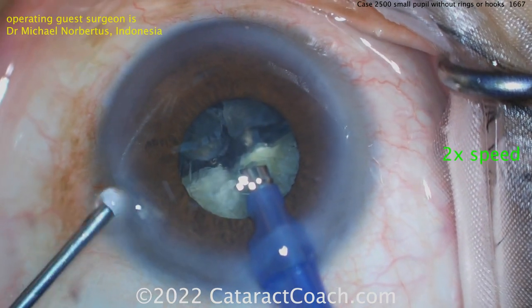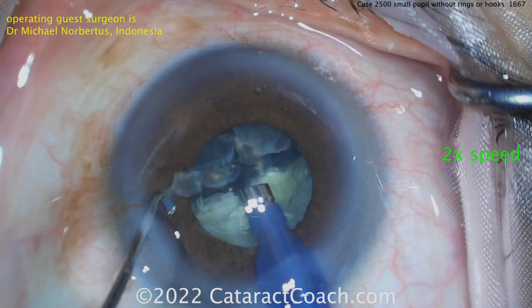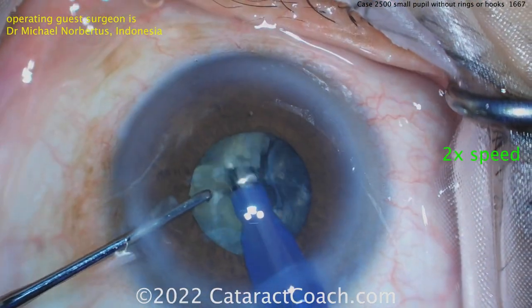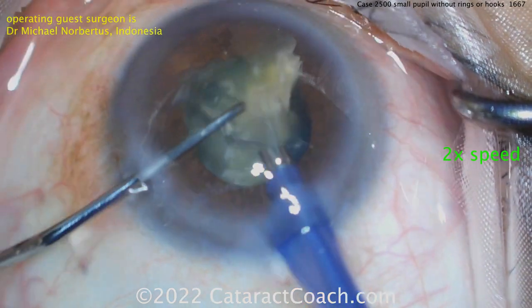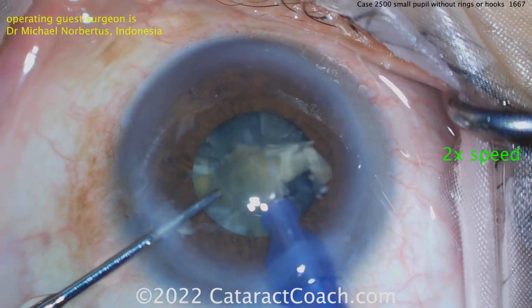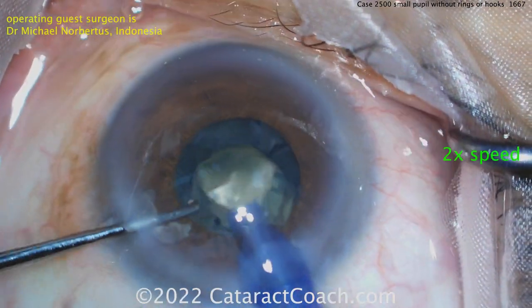Re-coating the endothelium - so smart. Remember to go to position zero on the foot pedal when you recoat. Now rotating this around here and smaller pieces - maybe even sub-chopping some more. Those get wolfed down pretty easily and here's the last piece.